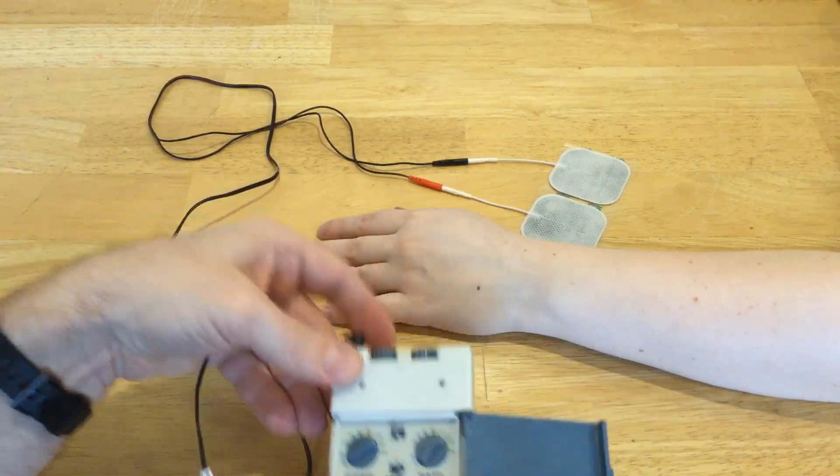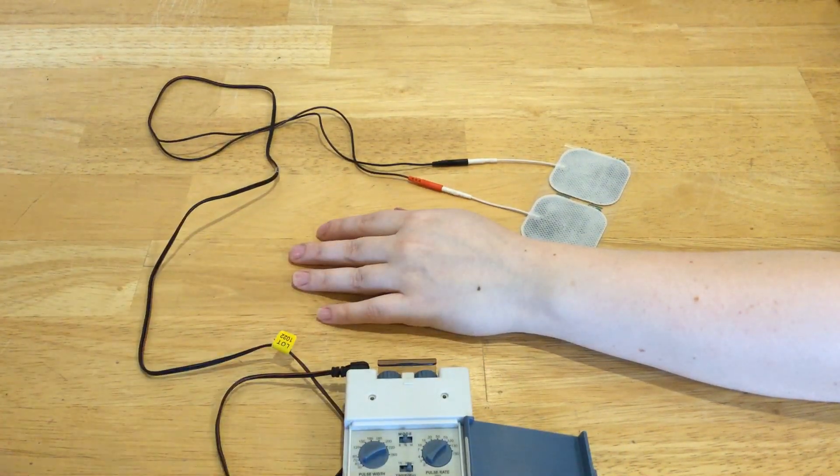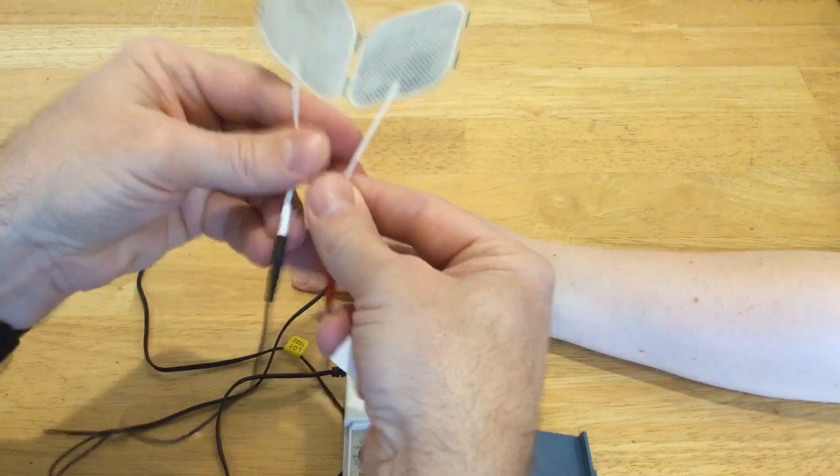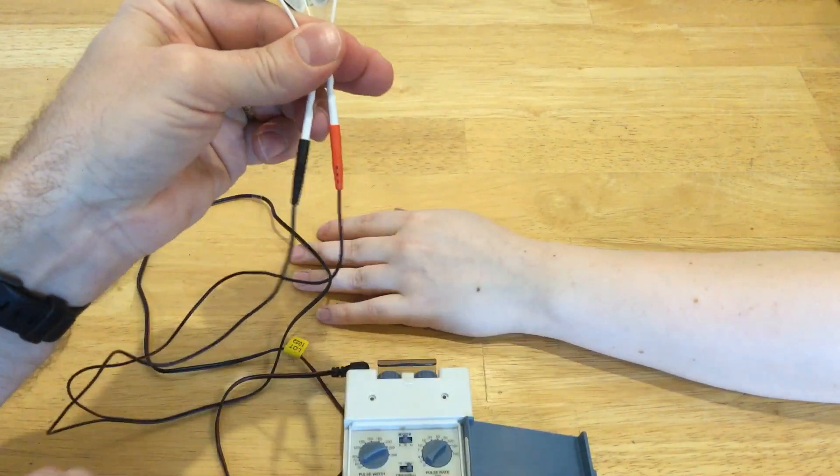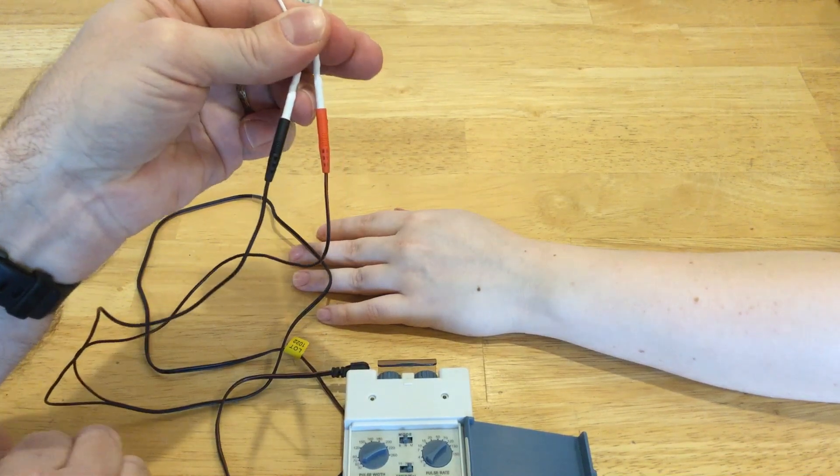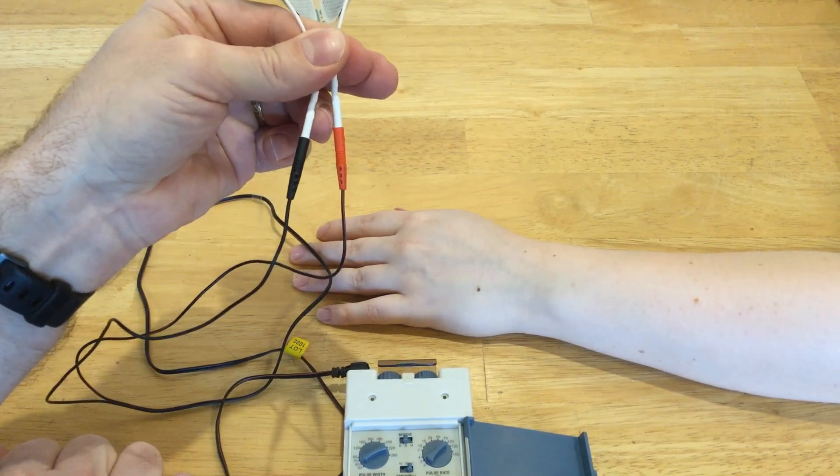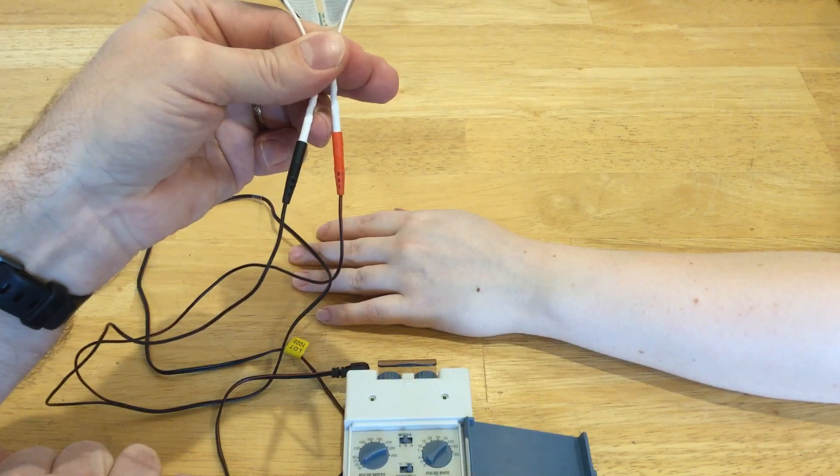So we're just going to try this a minute here. You'll also notice that with this machine, you have one red lead wire and one black lead wire. That would lead you to believe that they do different things, but they do not.